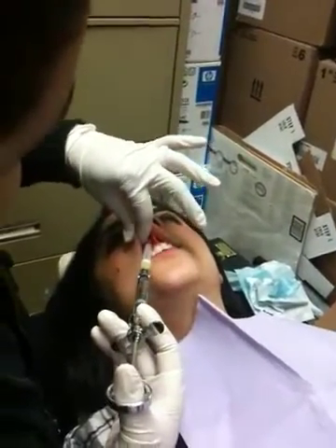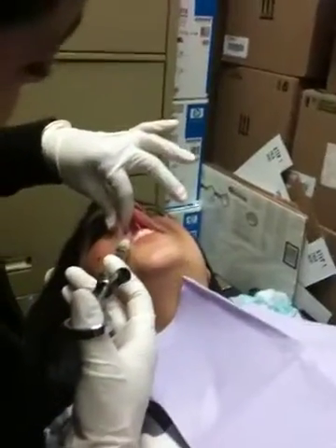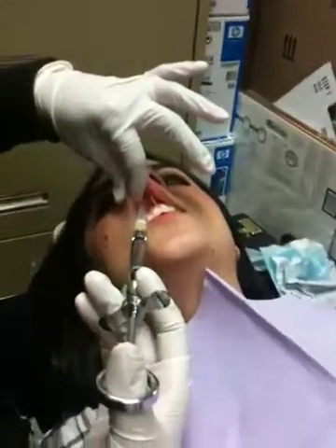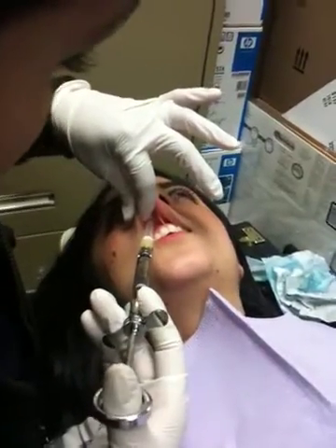We're going to be using topical. Yeah, the needle is going to go through quickly when you do it that way. And like this? Long axis of the tooth. Which tooth are you numbing? Don't forget about the long axis.